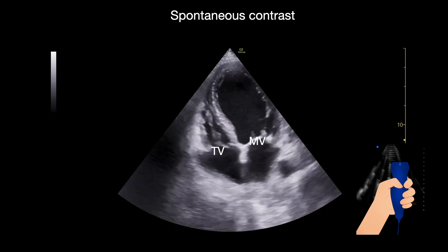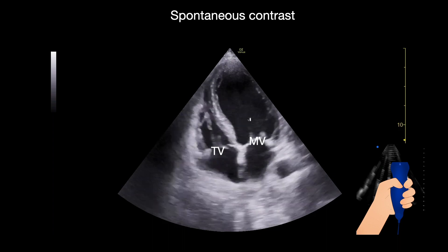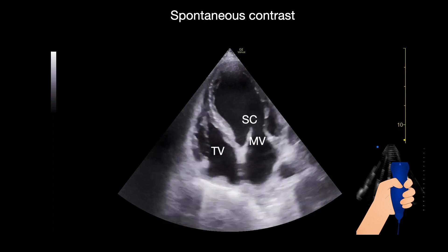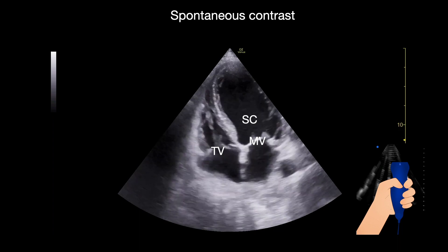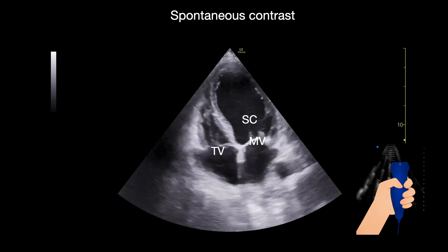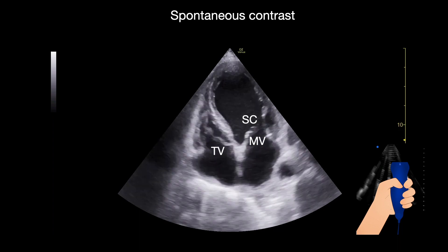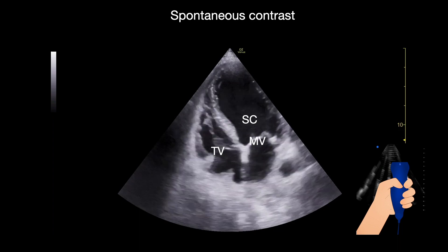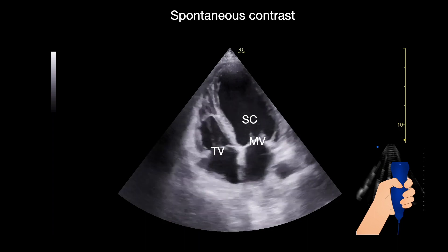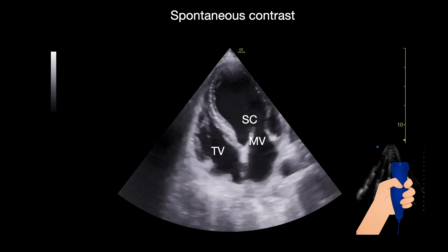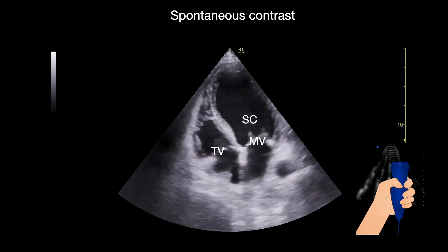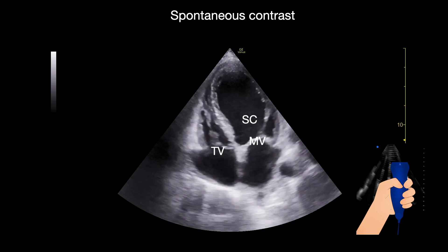Spontaneous contrast is here, and it's very important to know that its presence is associated with thrombi, especially when found in the left atrium and the left atrium appendage.